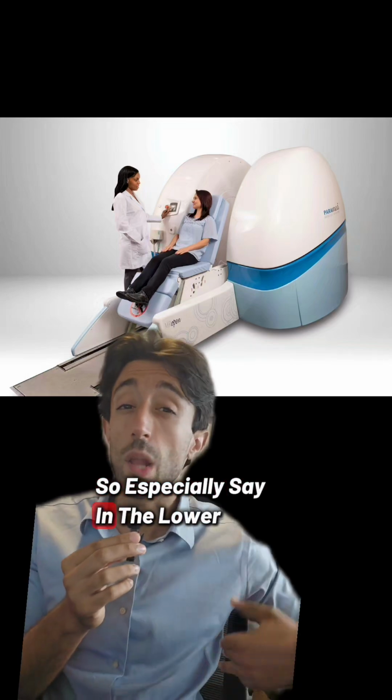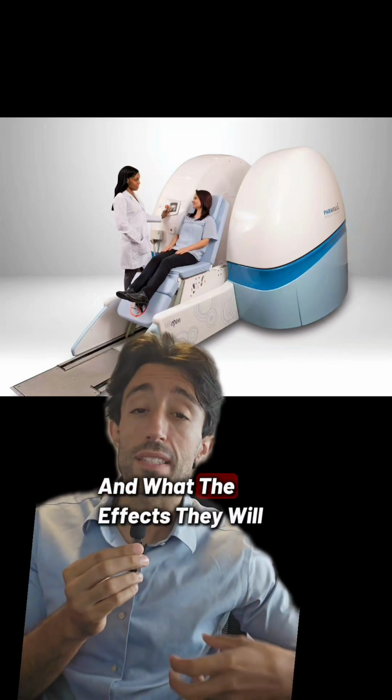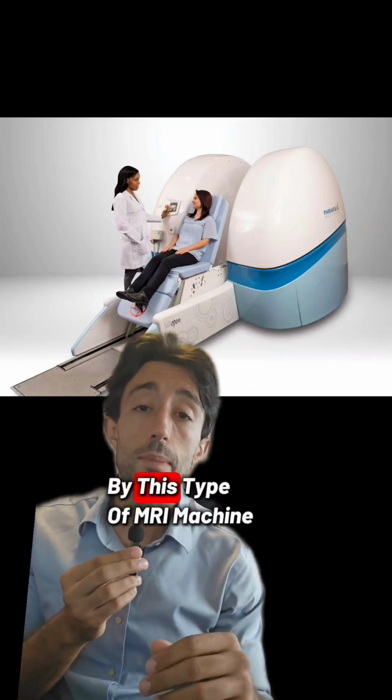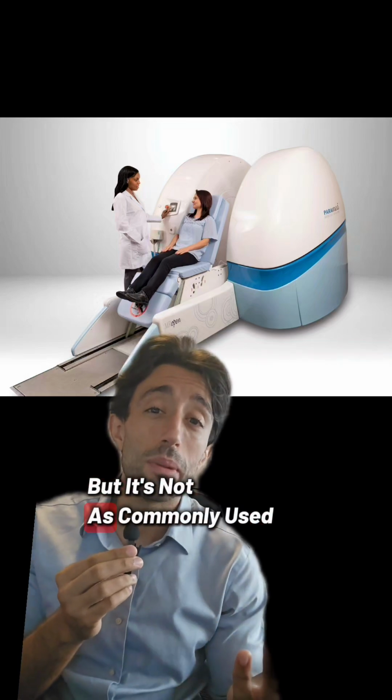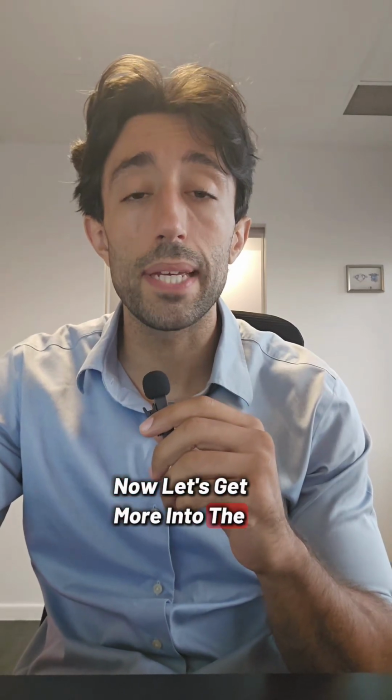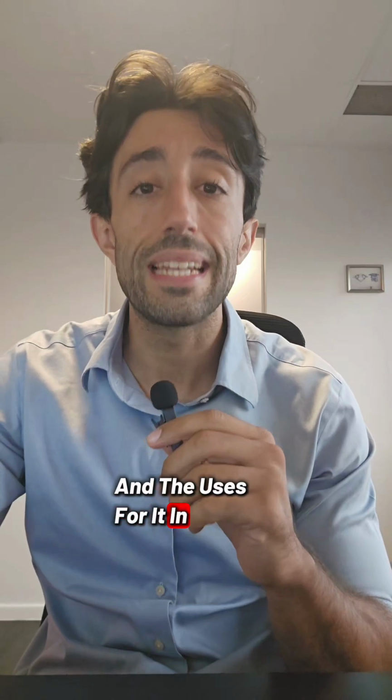So especially, say, in the lower back, the discs and the effects those discs will have on the nerves, this can be particularly well shown by this type of MRI machine, but it's not as commonly used. So that was the different types of MRI machines. Now let's get more into the applications and the uses for it in a clinical setting.